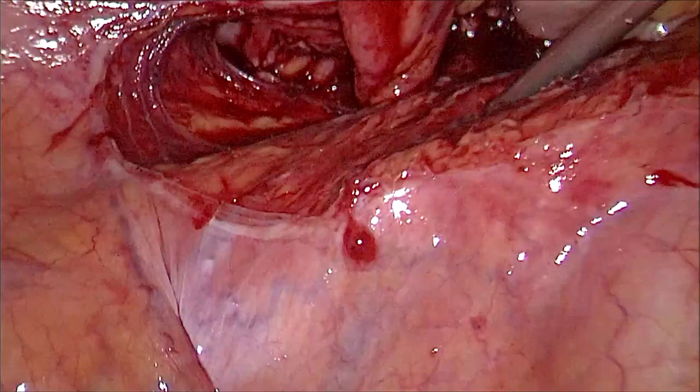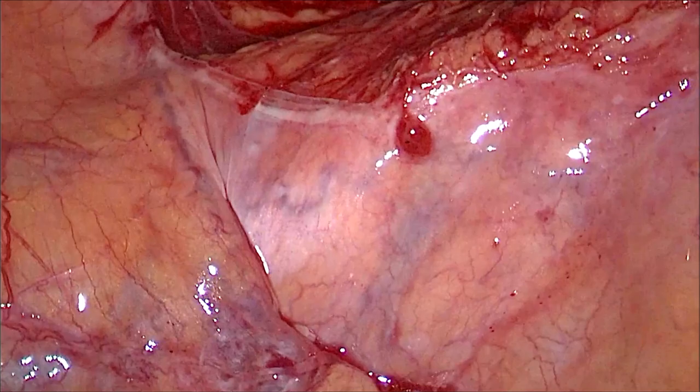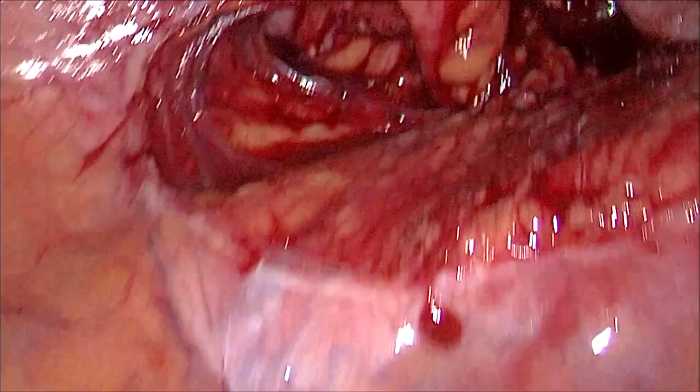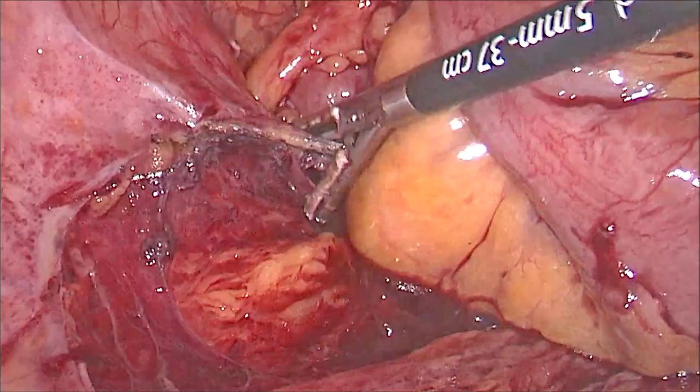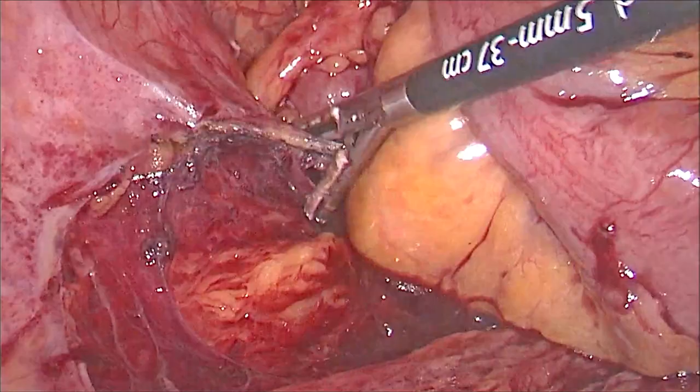The camera is shifted back to the suprapubic port to confirm the position of the ureteric catheter which has been left below. The final attachment is also taken down. The umbilical incision is then extended and the anastomosis is done extracorporeally. Thank you.